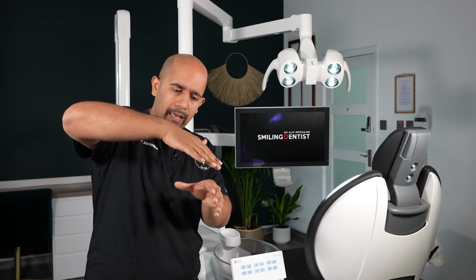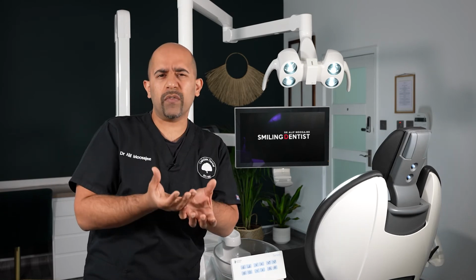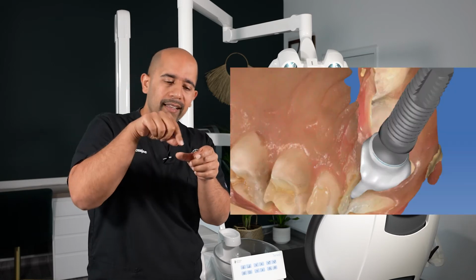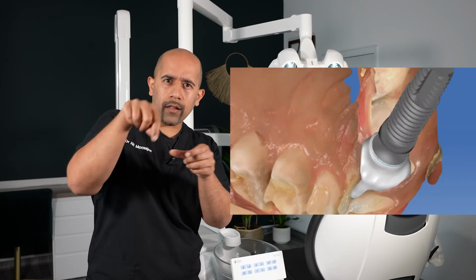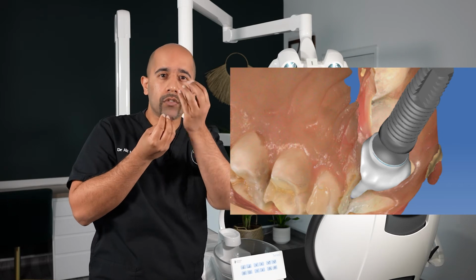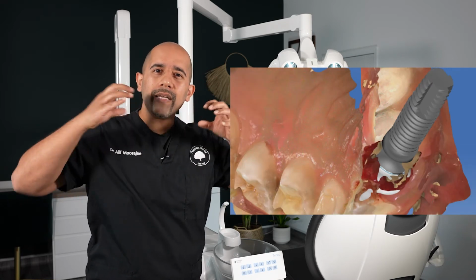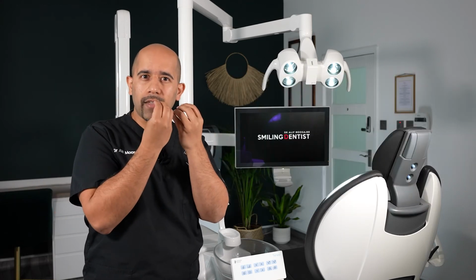So you can shape not only the supragingival portion to look like the tooth before, but you can carefully shape the subgingival portion as well, so that it supports the soft tissue and actually encourages a little bit more growth, so you get a better thickness of the tissue there.